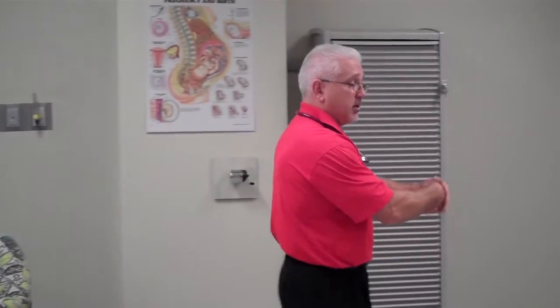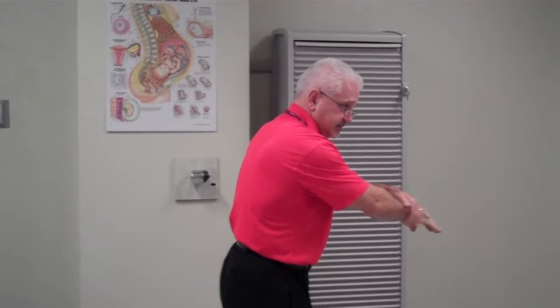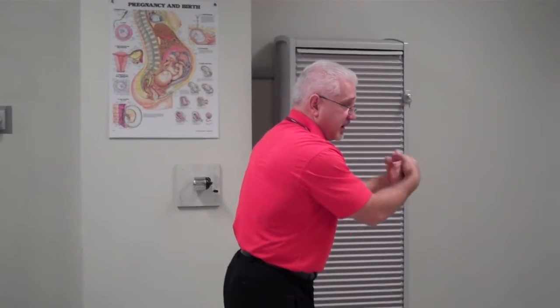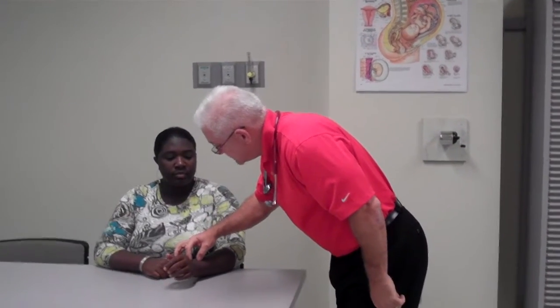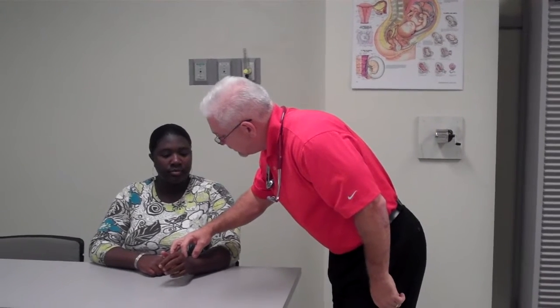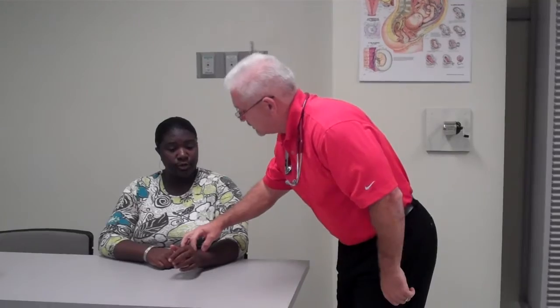But before I do that, I have to go ahead and wash my hands. I'll go over to the sink. I will wash my hands for 15 seconds. And after I've washed my hands, I will proceed to the patient and say, ma'am, I need to just go ahead and check your ID. And it says here that your name is Stacy. And what is your date of birth, Miss Stacy? March 7th, 1972. Okay, very good.